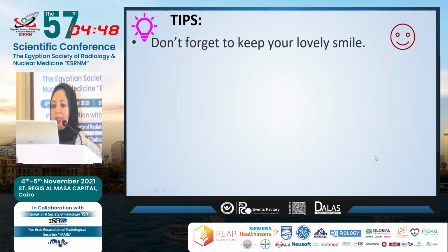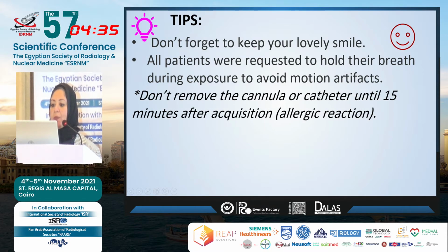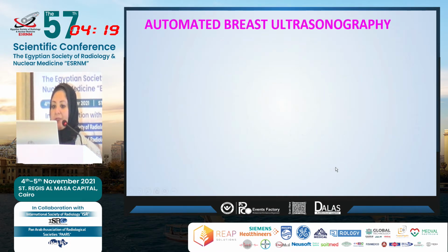Here are some tips for you. Don't forget always to keep your lovely smile all the time through the examination to keep the patient relaxed. All patients were requested to hold their breath during the exposure to avoid motion artifact, and don't remove the cannula until 15 minutes later. Sometimes the radiologist may request a delayed film for any delayed enhancing lesion, and always ask for previous films for comparative studies.